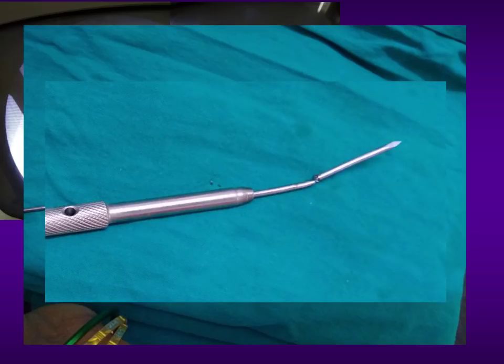So if there is resistance, we normally use hand drills only. I don't want to use power drills in these osteoporotic elderly patients to pass the screws. So it gives me an idea about what is happening inside. So it's better to use hand drills and hand reamers rather than power reamers in these cases.